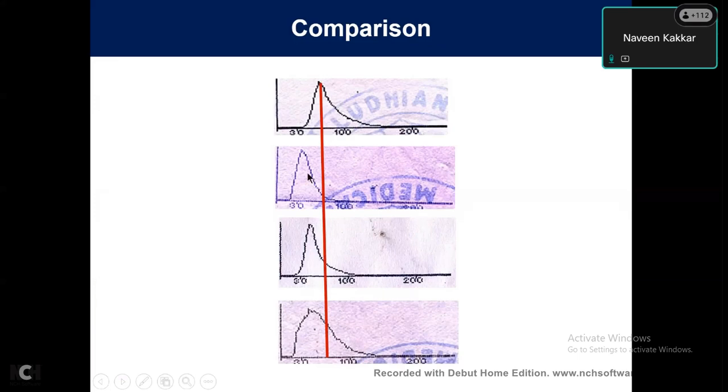Beta thal versus iron deficiency, narrow peak. So again, the degree of poikilocytosis is not much. That's why the normal RDW, here RDW was 20. So 40, 20, and 28. It's reflected in the histograms. They do speak a lot.